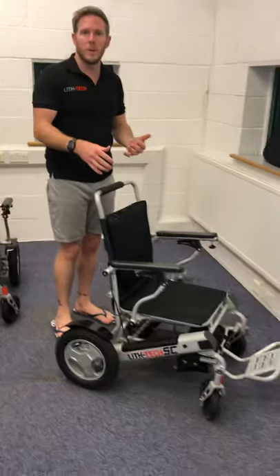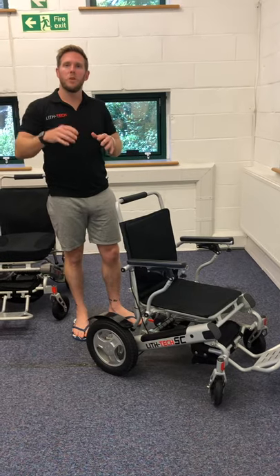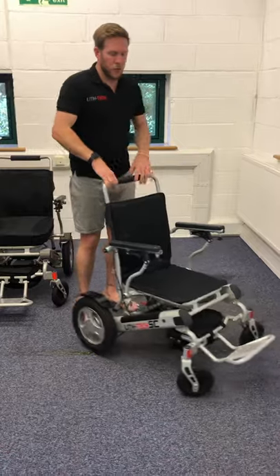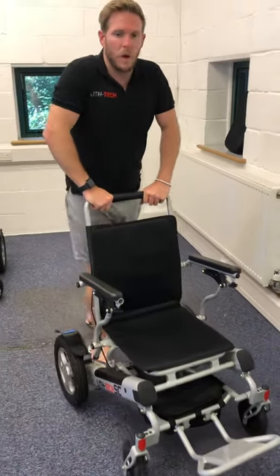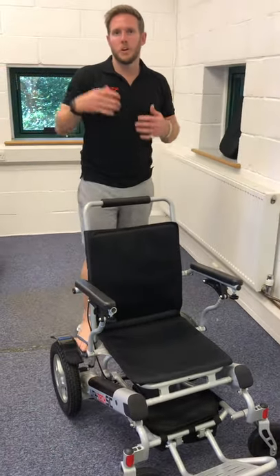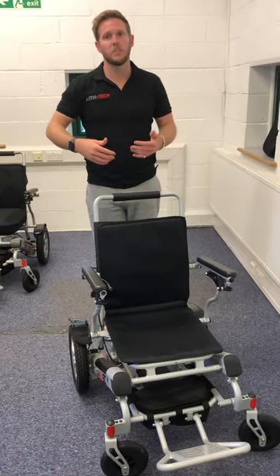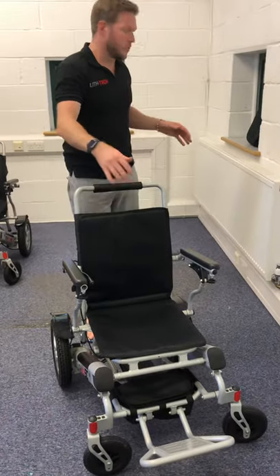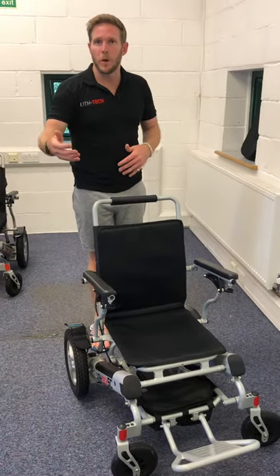In push mode you can push someone in it really easily. The better quality the motor, not only will it work well electrically but it'll be much easier to push. You can use this even as a stroller, standing behind it and taking your weight — exercise is good, and if you don't use it you lose it. We do encourage our customers to stay as mobile as possible. When you get tired, just pop the motor back into electric mode and use the joystick.